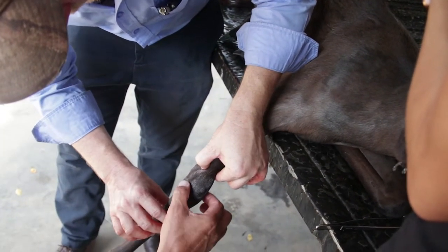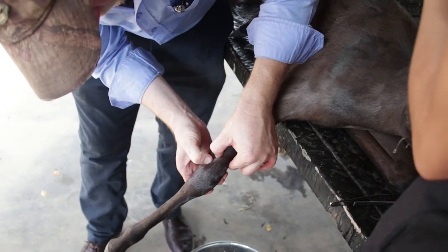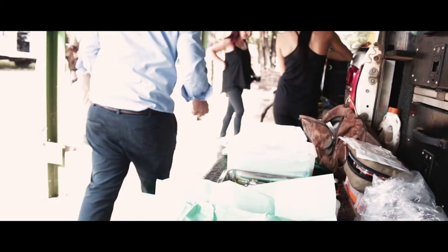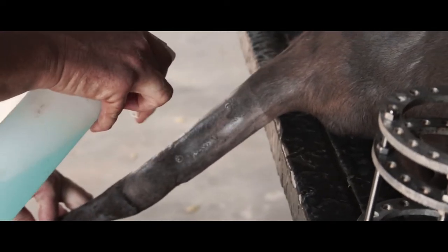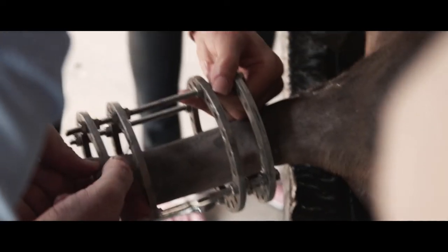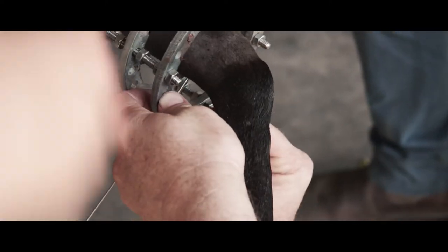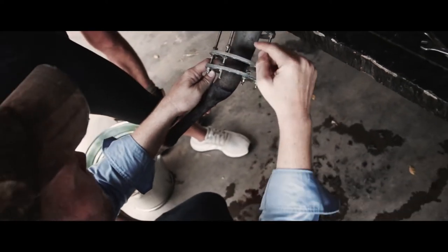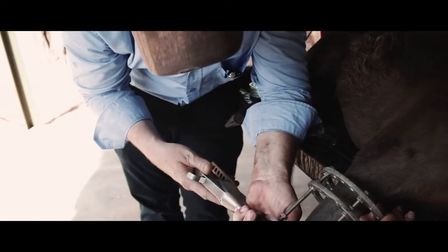The leg will be straight once we're done. You've just got to draw one there - you're going to find bone in the line. You want one pin on the top plane and one on the other plane, so when you draw them they don't touch each other. One pin this side, one pin that side, and the same on top. The problem is we can only do two pins, and you want them 90 degrees to each other - one this way and one that way. Two pins at the bottom, two at the top. It just tensions the wire from that side to this side.